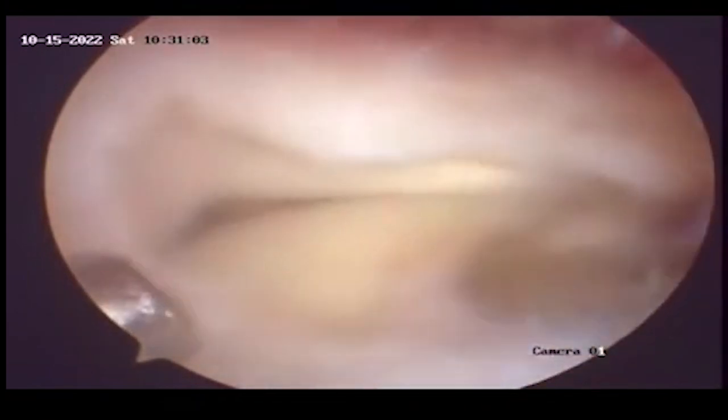After localization of the tear, the periosteum on the footprint area will be removed with a motorized shaver. After abrasion of the footprint area to get a bleeding surface, an awl is used to make holes for entry of the giant needle at the junction between the cartilaginous head and the footprint area.